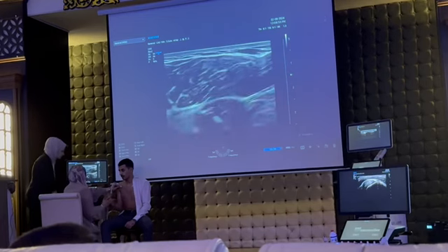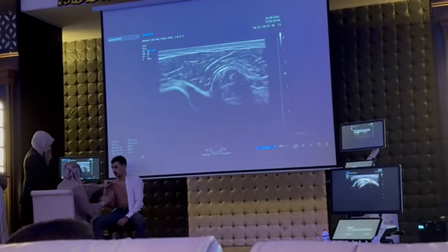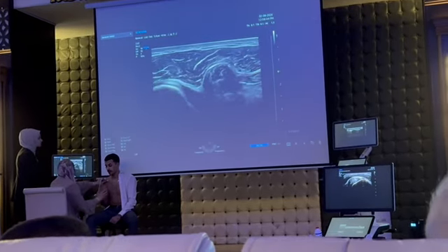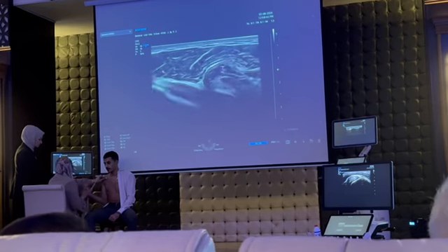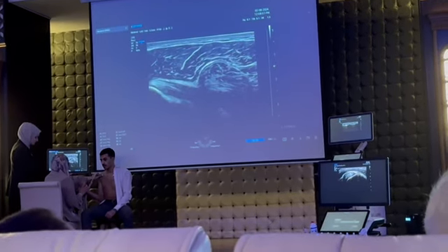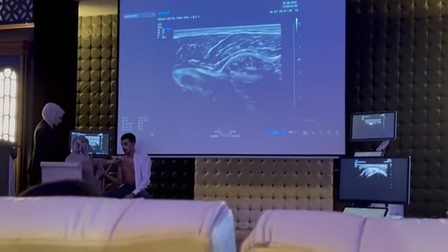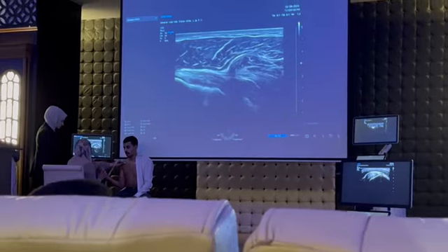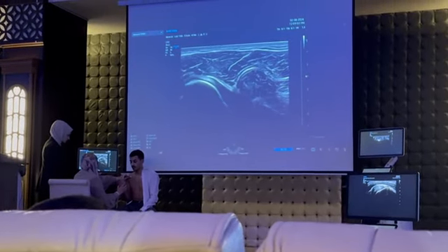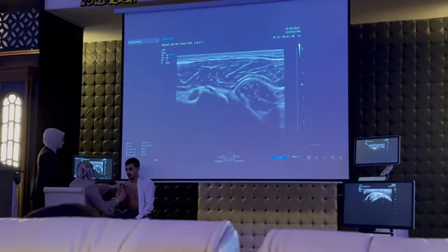So I do now examination of the subscapularis muscle. You see this muscle comes out. Now this muscle comes below the coracoid process. This subscapularis muscle, how to examine it? Do action against its normal action. External rotation, the subscapularis comes outside the coracoid. Now internal, you see, this muscle comes below the coracoid process, and the lesser tubercle comes beside the coracoid process.